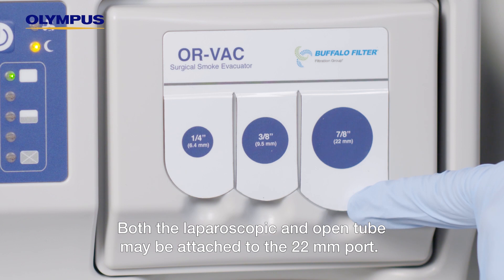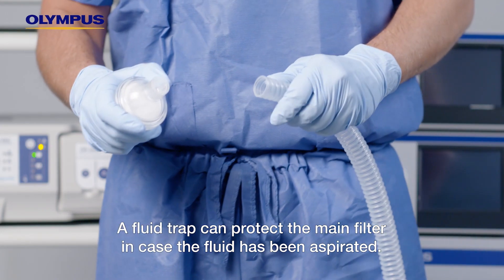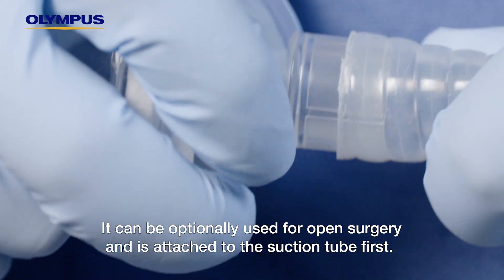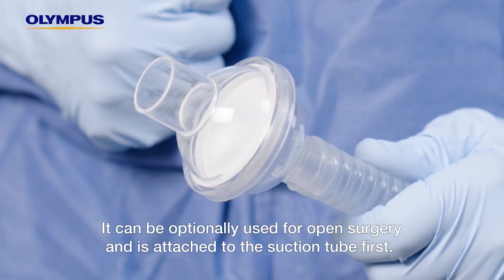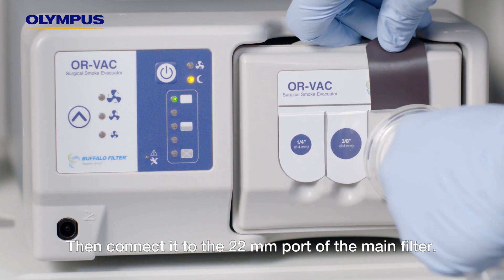Both the laparoscopic and open tube may be attached to the 22 millimeter port. A fluid trap can protect the main filter in case fluid has been aspirated. It may also be used for open surgery and is attached to the suction tube first, then connect it to the 22 millimeter port of the main filter.